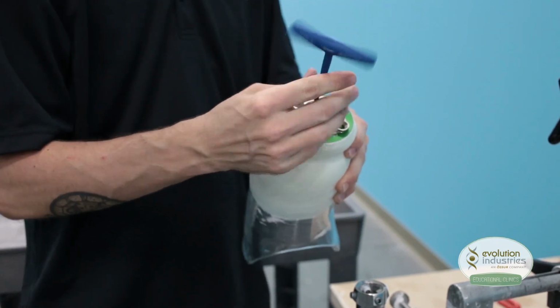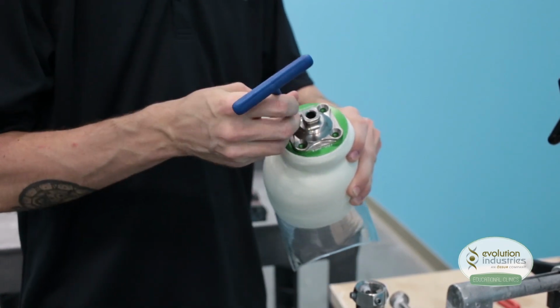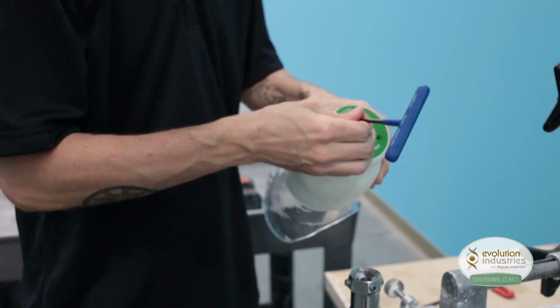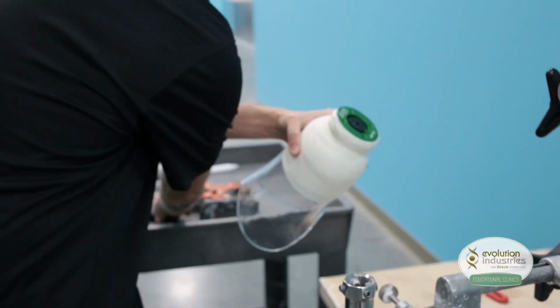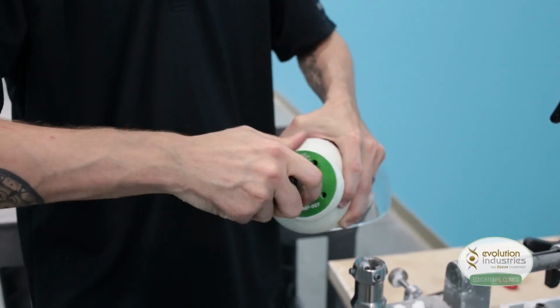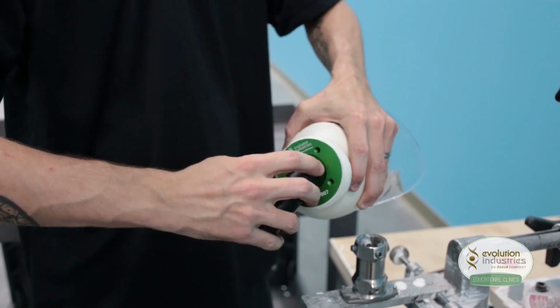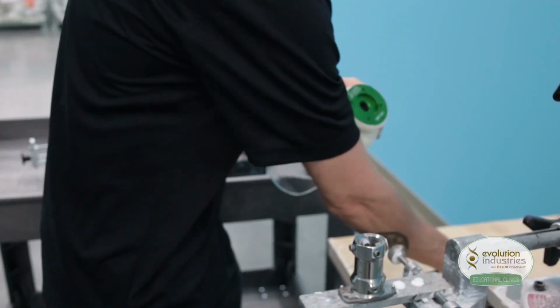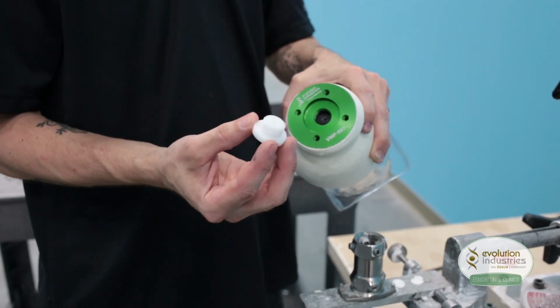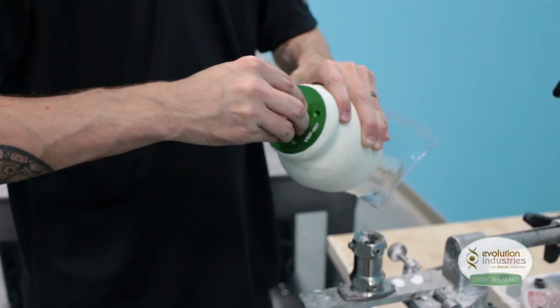We do this to ensure that when we fill it with plaster, the duckbill or seal are not filled with plaster. Turn it counterclockwise to release the housing, and everything simply pops out together. And replace it. You don't have to worry about lubricating it at this time. We're just using it as a spacer.